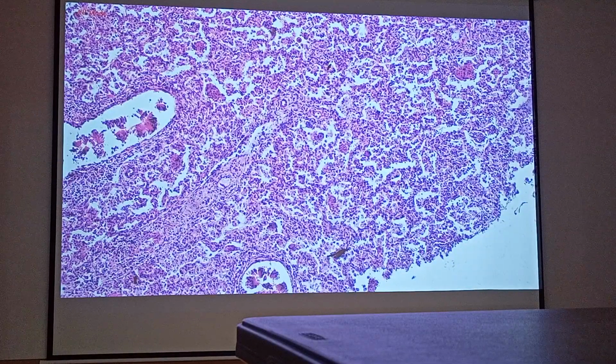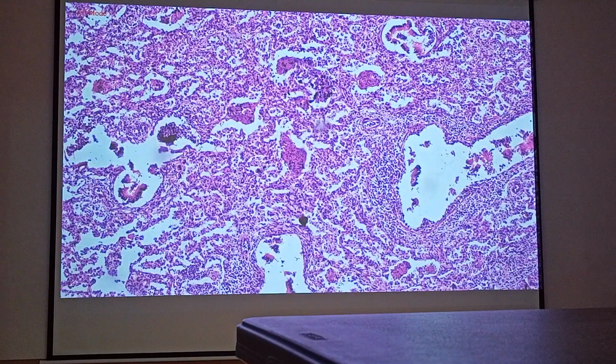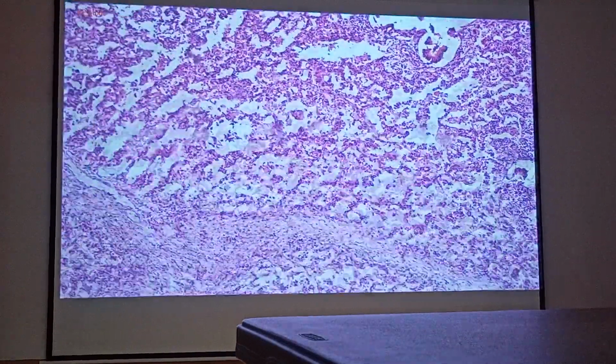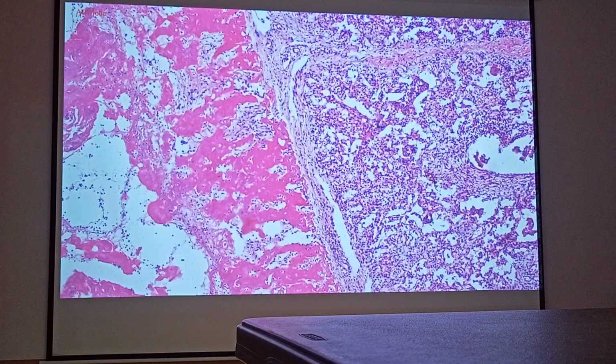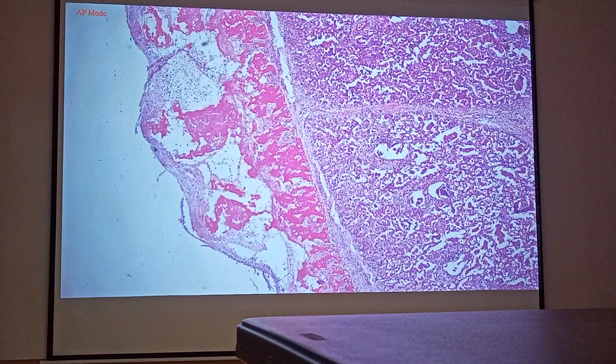Again, it will be difficult to identify the lung tissue because much of the tissues of the lungs have been liquefied already by the neutrophils. And then, unfortunately for this individual, the inflammation that has developed first in the lungs has extended into the pleura, covering this lung, so that you will be able to see the surface of the pleura, which is not anymore smooth because fibrin has become deposited. There is edema already in the pointed clear portions.